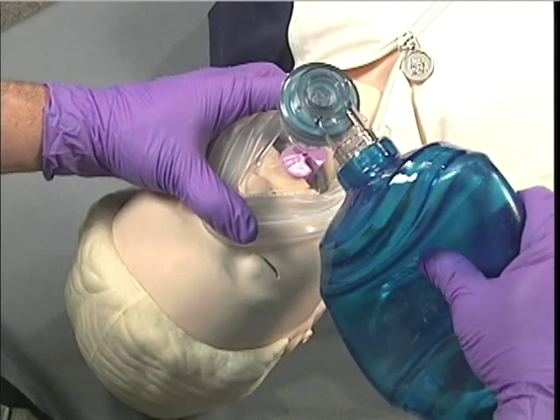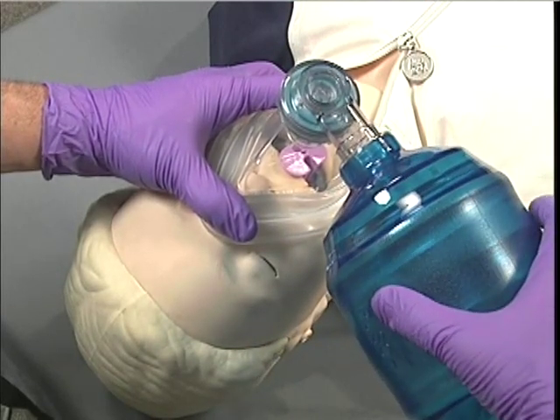Finally, check for adequate air exchange and ventilate the patient as necessary.